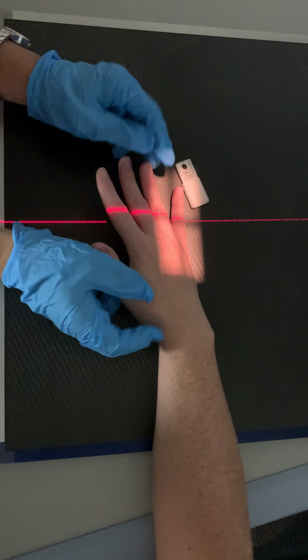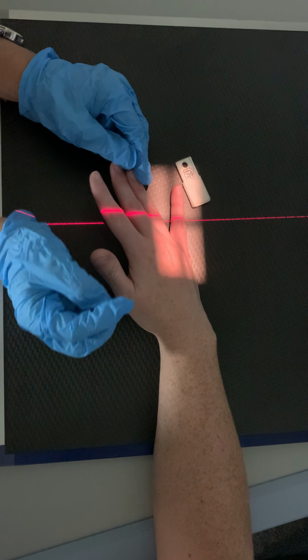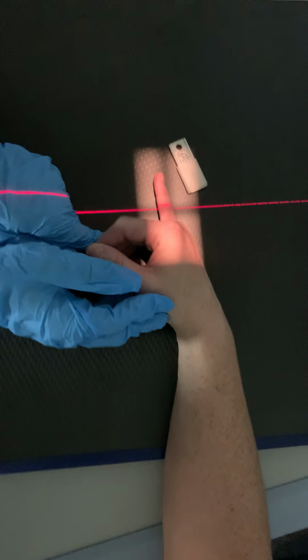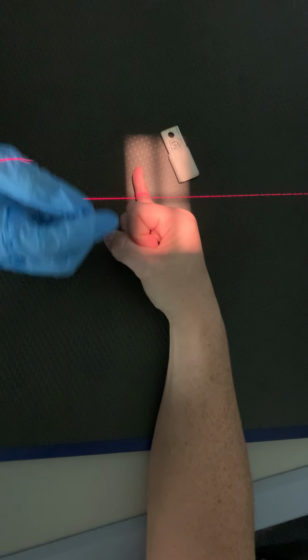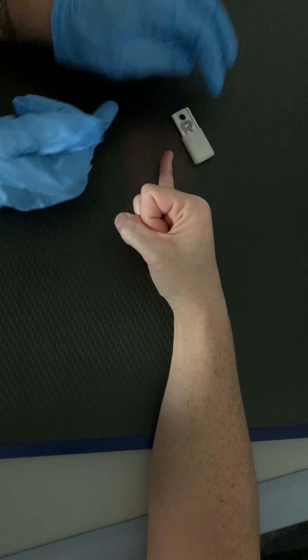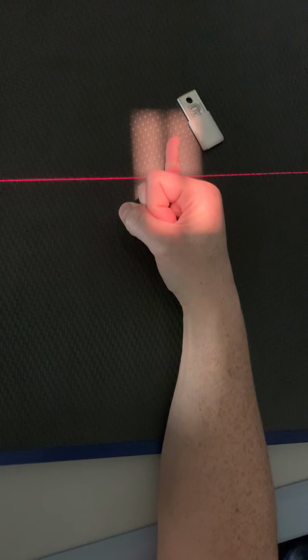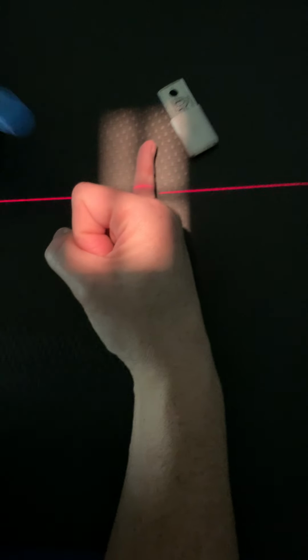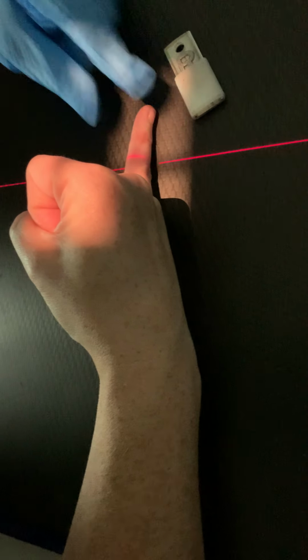All right, so the last we're gonna do are the laterals of the digits, okay? So let's do 5th digit first. Ball up a fist for me. So your finger has to be in a true lateral. You look at your fingernail to see, is it coming straight down to the IR? Coming into the proximal interphalangeal joint, okay?